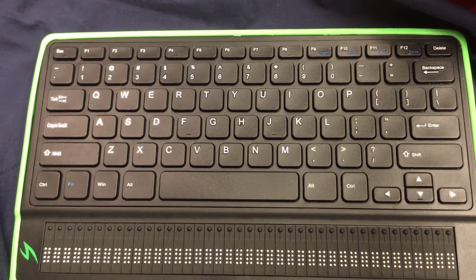Hello and welcome to another video about the Mantis Q40. Today we're going to look at a couple of features that you might want to take advantage of, or know how to turn on, off, and configure. The first thing is that the Mantis, though it is a full QWERTY keyboard, can also be used as a six-key entry keyboard. I'm going to show you how that works.